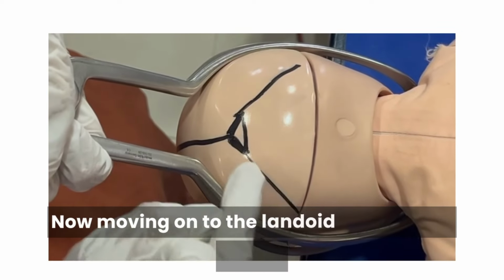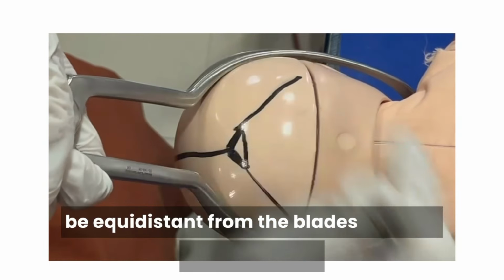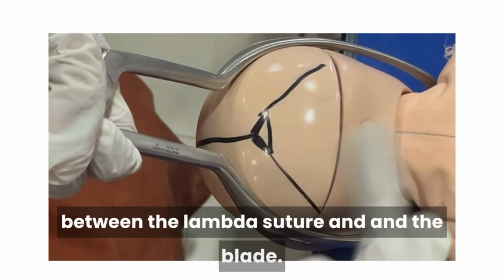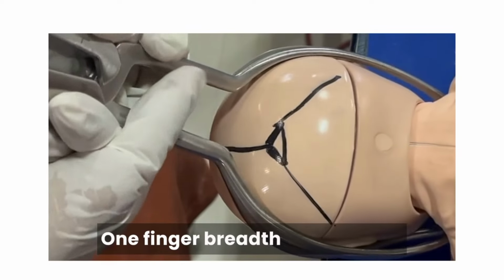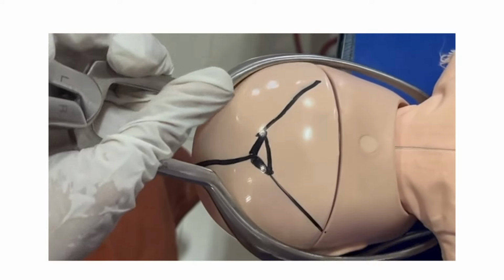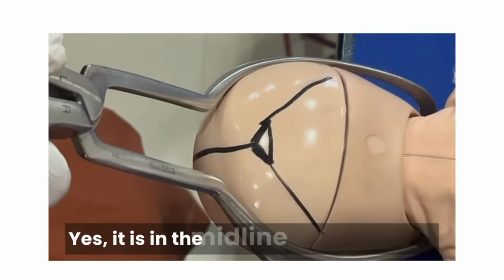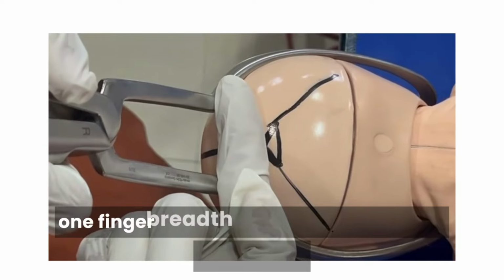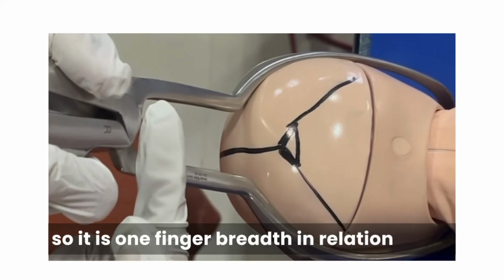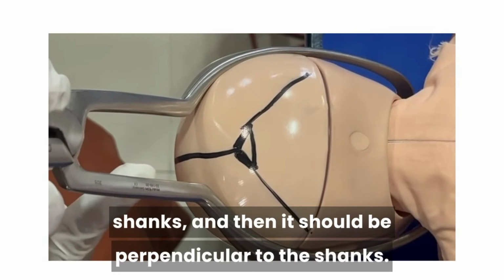Now moving on to the lambdoid sutures, they should be equidistant from the blades, and 1 finger breadth between the lambdoid suture and the blade. Coming to the sagittal suture, it should be in the midline. Yes, it is in the midline, and it should be 1 finger breadth in relation to the shanks. So it is 1 finger breadth in relation to the shanks, and then it should be perpendicular to the shanks.